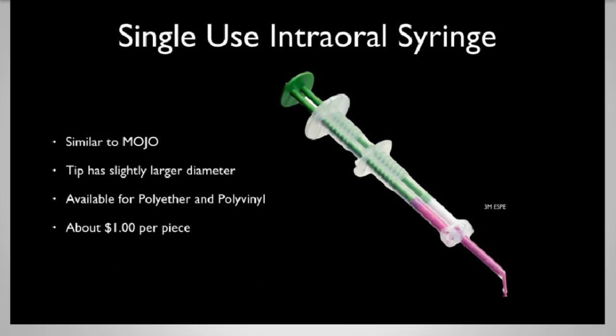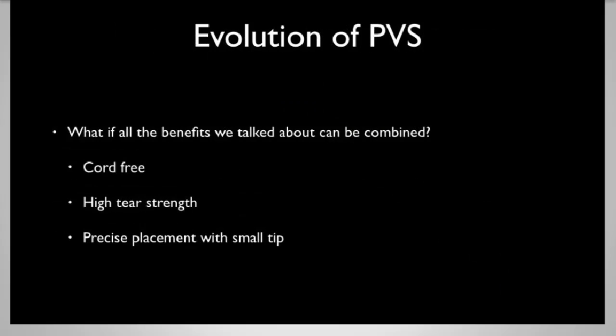3M's come out with a similar device. It's a very similar concept that's roughly the same price point, maybe a little bit more. They also have a polyether option as well. I really believe these handheld units for 1 to 3 teeth, maybe 4 teeth, work very, very well, and something to definitely consider if you're struggling with the traditional yellow intraoral tips.